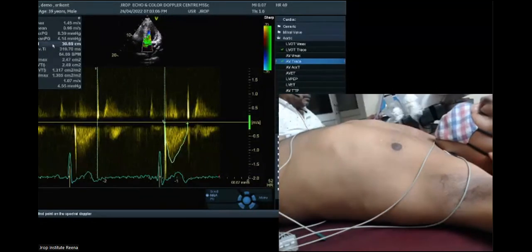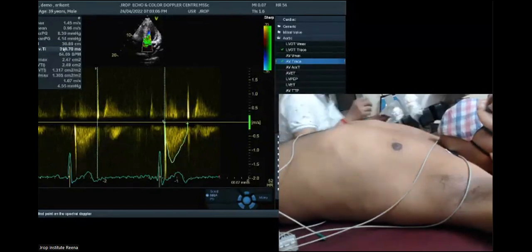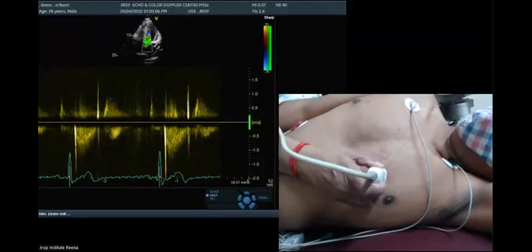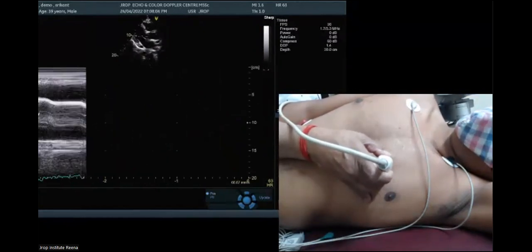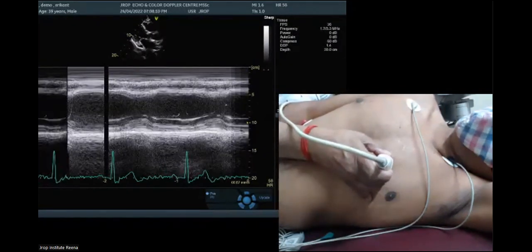Okay, sir. I want to know exactly the M mode measurement of the LV dimension, if you can show me again or in the next class. We have given it up completely. I showed you that slide. We were doing M mode measurements, but we were getting bigger measurements when correlating with other patients. So we started shifting over to 2D measurements. So this is how I'm going to take an M mode measurement across 2 dimensions. That's how you take it.